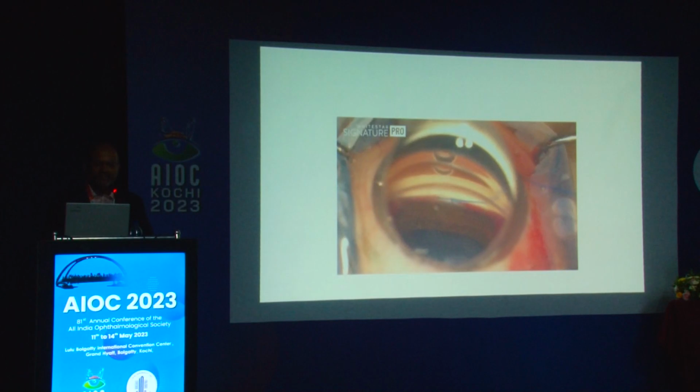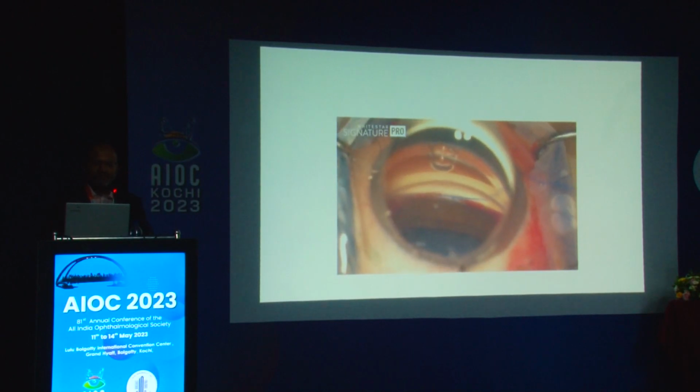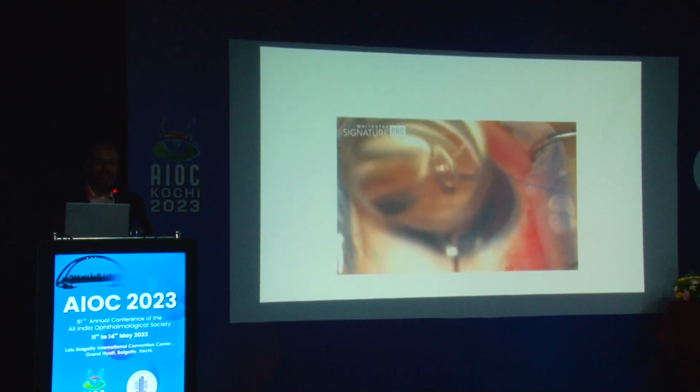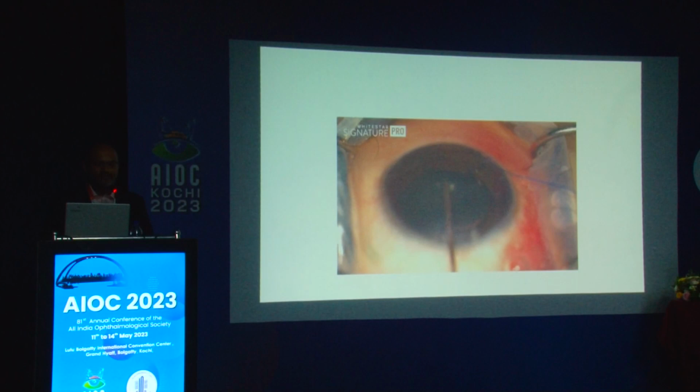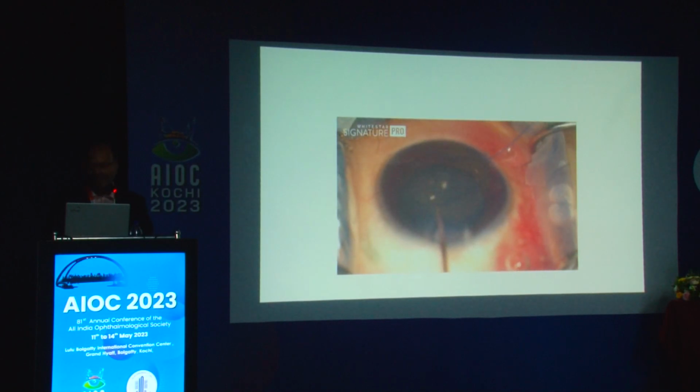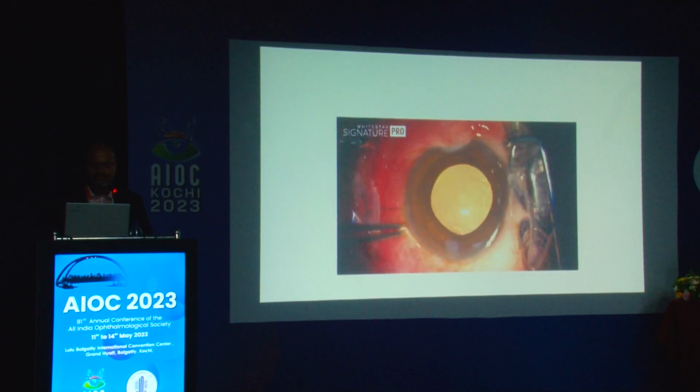So the same patient, we went in anti-clockwise, wasn't happening. We went in clockwise, that wasn't happening. Then we came back and again went anti-clockwise, that worked. So the important thing is that's why it takes 50 minutes. So you should not lose perseverance when you do the procedure.